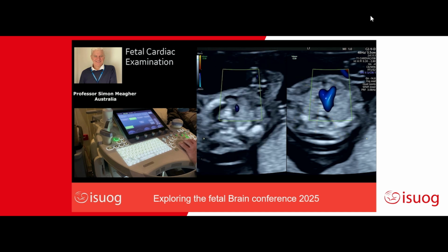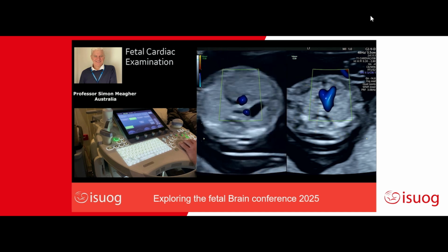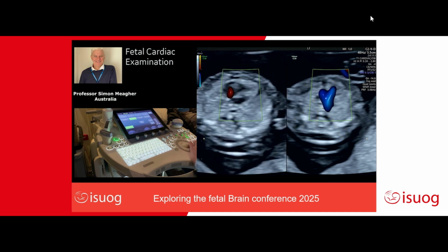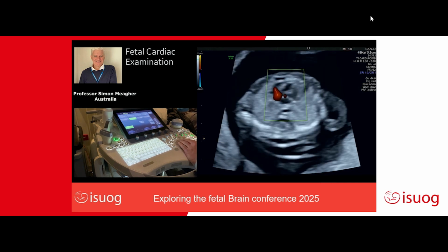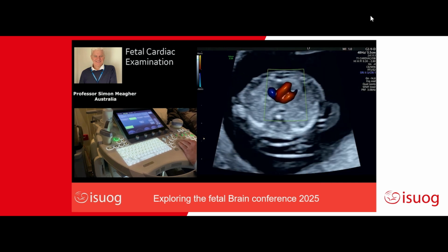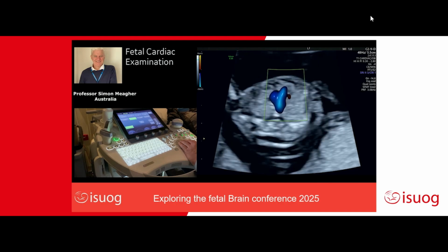And I can unfreeze this and then go back from that to the 4-chamber. And that's, I think, a good exercise to get into, showing a split image showing these two and saving that to your archive. You can then go to full screen and then just repeat that in real time, showing 4-chamber, and up to the 3-vessel tracheal view.